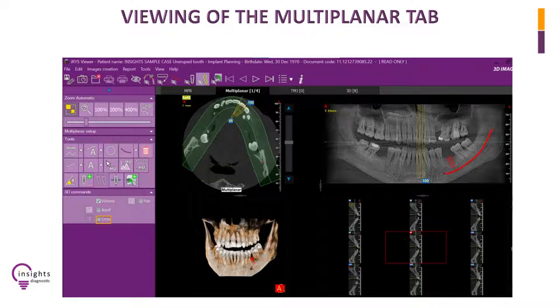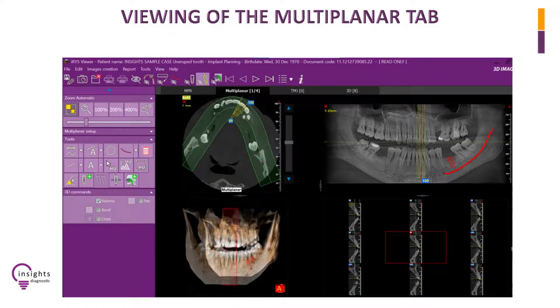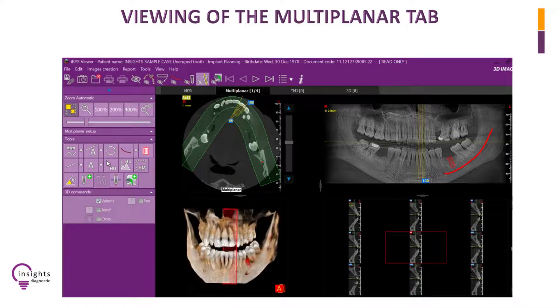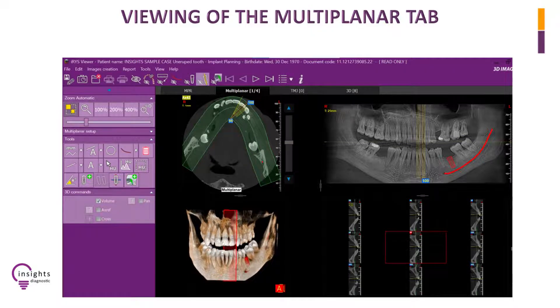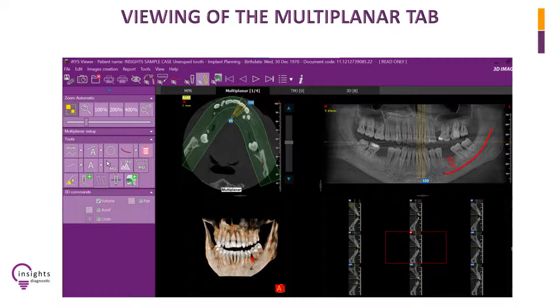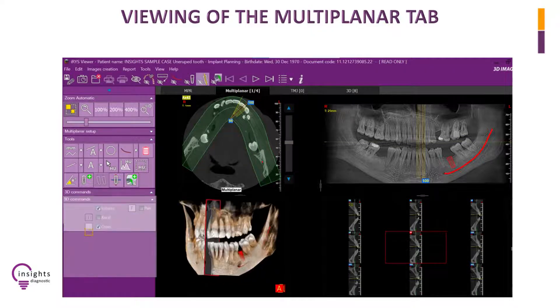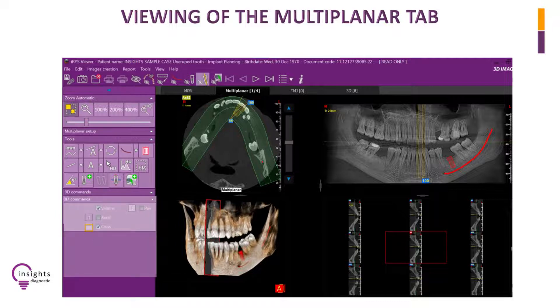Click on Cross at the lower left corner of the toolbars under 3D commands, to see the red vertical plane as the slice representation in the 3D model. Click on letter T at the adjacent left of Cross to make the red plane transparent.